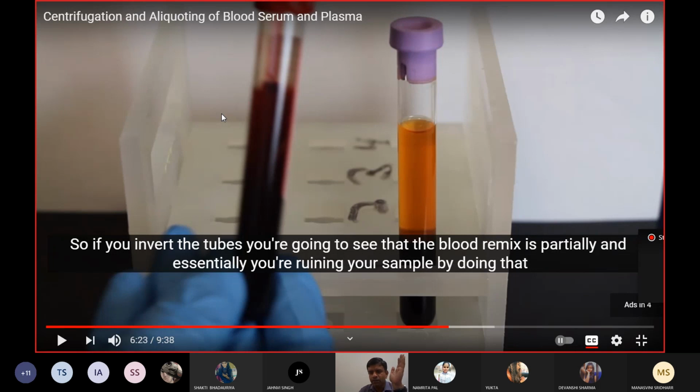ठीक है, ऐसा नहीं कि ट्यूब्स लेके तुम डांस करते हुए अपनी लैब तक जा रहे हो या वर्क स्टेशन तक जा रहे हो. Okay, you have to hold them with very stable hands.